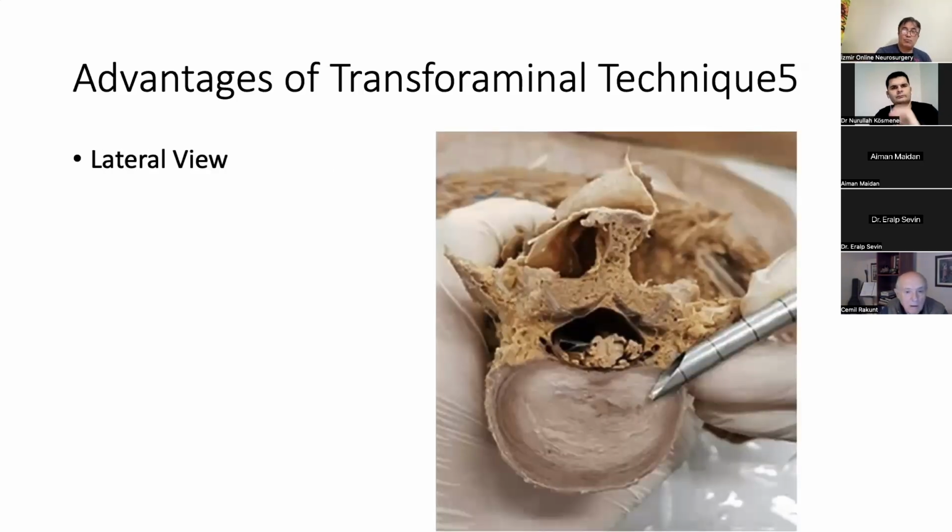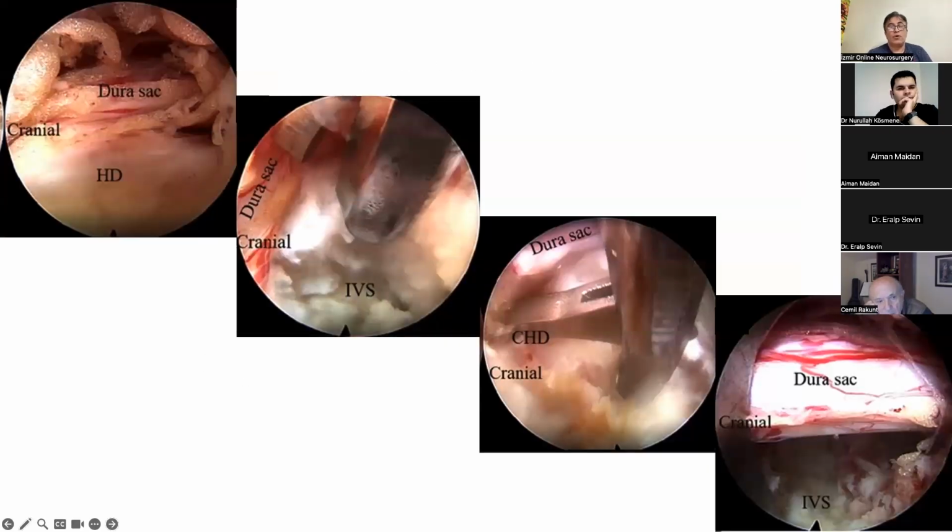However, in my opinion, uniportal transforaminal endoscopic discectomy is an entirely different procedure from microdiscectomy, uniportal translaminar endoscopic discectomy, and UBE. This is because you see the dura and disc from the lateral side. Theoretically, ventral epidural decompression and intradiscal surgery are best performed using a transforaminal approach with minimal neural retraction. Transforaminal endoscopic lumbar discectomy is a representative keyhole surgery that prevents excessive neural retraction.